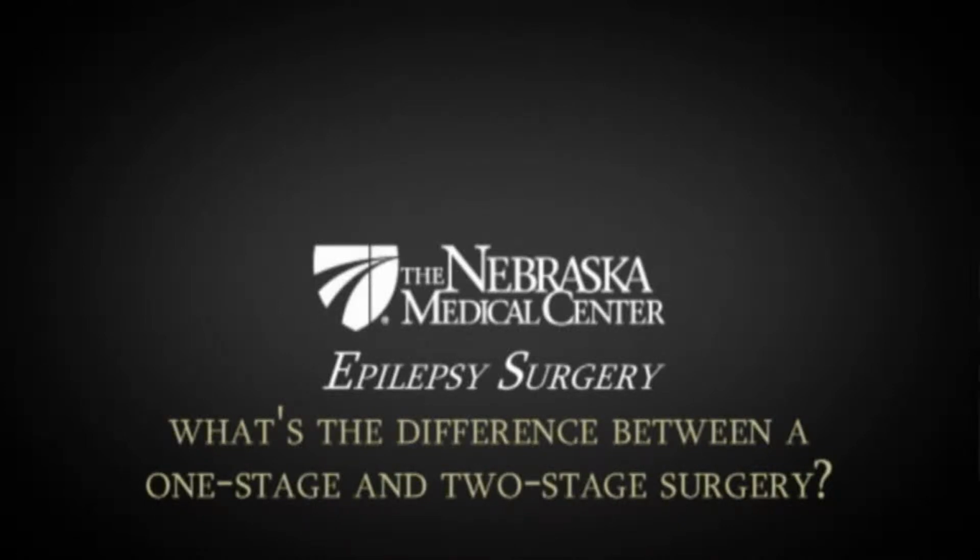So a two-stage procedure would be done if we initially do a craniotomy, or the opening, and place electrodes, which we call grids, on the surface of the brain underneath the covering of the brain, which is called the dura. So we will place those and close everything back up, and the patient will then go to the ICU where they're monitored. The monitoring is the same as when they have their inpatient video EEG monitoring, except now we're recording directly off the surface of the brain.